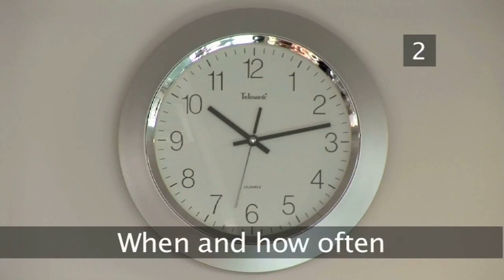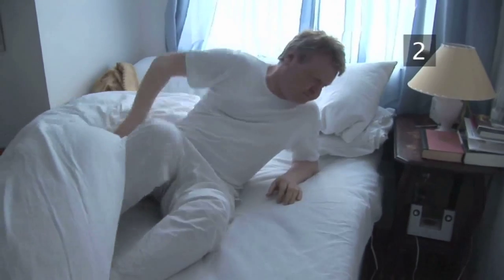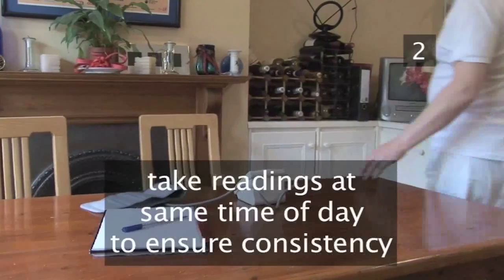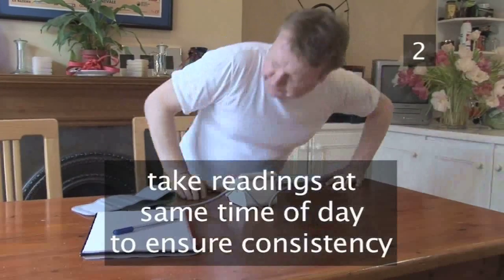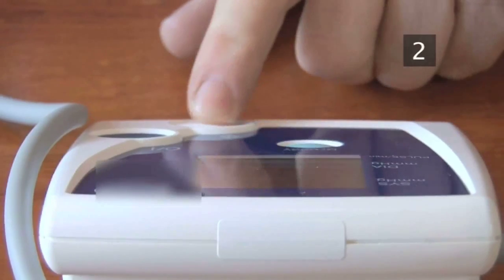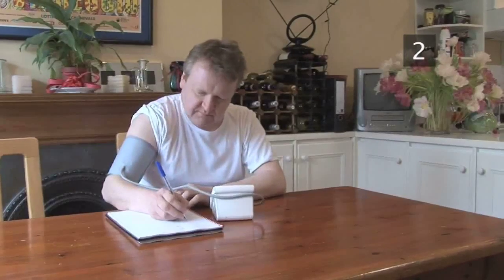Step 2: When and how often. Talk to your doctor or nurse about how self-checking can be of most benefit. They'll let you know how often is best for you. Many people check first thing in the morning and last thing at night. It's useful to take readings at the same time of day so that you are consistent and comparing like with like. Don't take readings too often as blood pressure levels go up and down and you could get a false impression, thus causing yourself unnecessary worry.